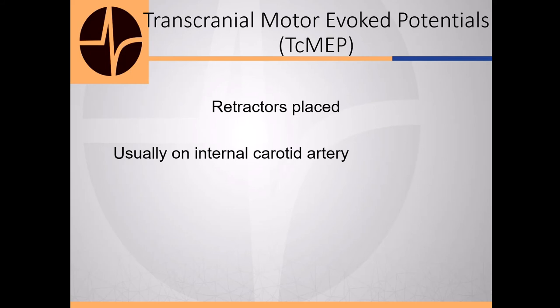So you ask them, did you just clamp? No. Did you just do something? Did you place retractors? Yes. Well, it's usually on the internal carotid artery, and you ask them, could you just reposition the retractors just a little bit? And they're going to do it. You're not going to get the response, no, I can't. They're going to try to move things around as much as possible.